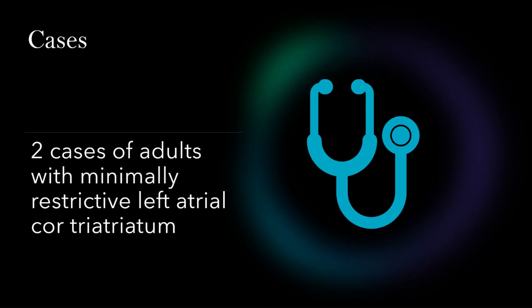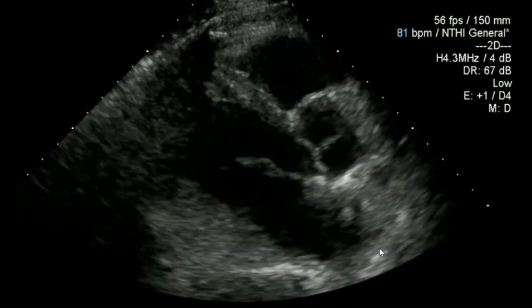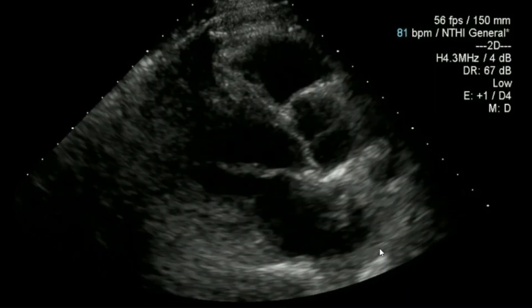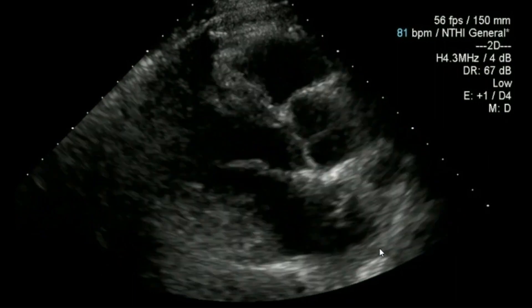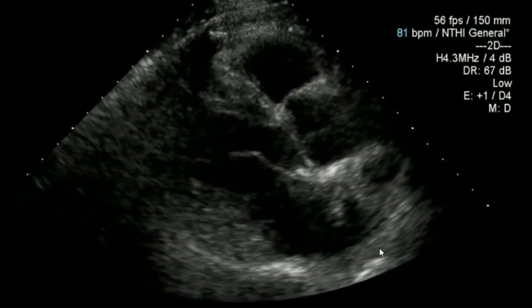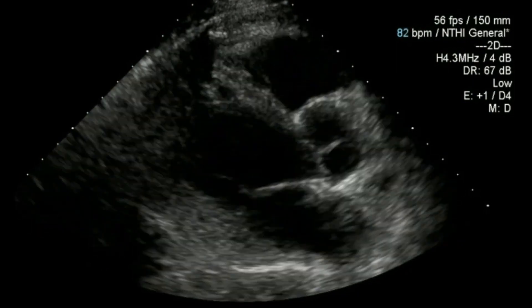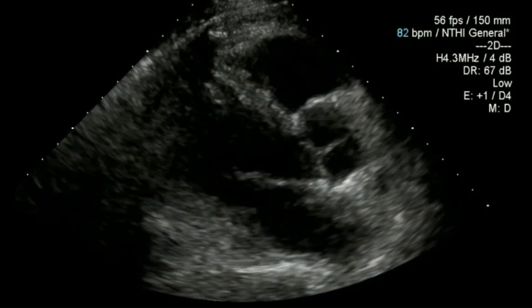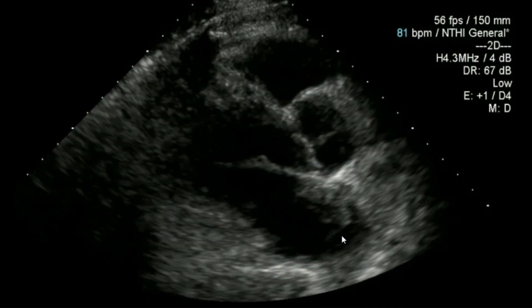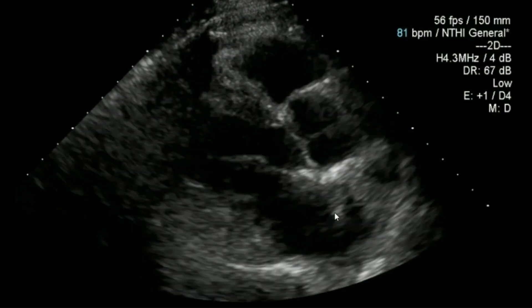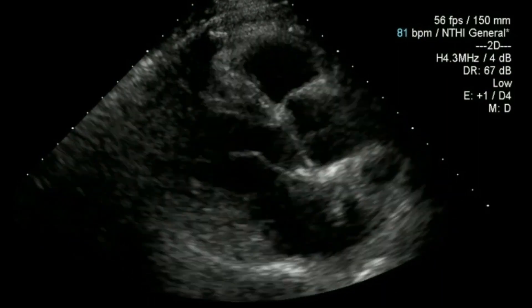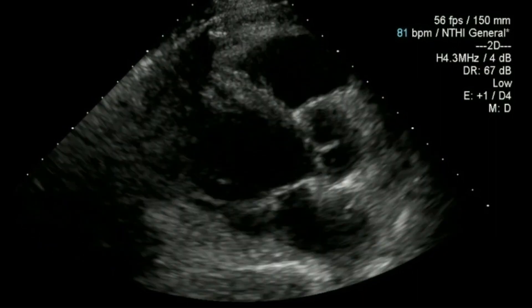Now I'm going to present a couple of cases of adults with minimally restrictive left-sided cor triatriatum. The first patient was a man in his 50s who had some increasing shortness of breath and slight swelling of the ankles. He did know that he had cor triatriatum. Looking at the initial image, the function looks fine — left and right ventricular. When you do look across the middle of the left atrium, you do notice an apparent membrane, although it's not that clear from that first view.